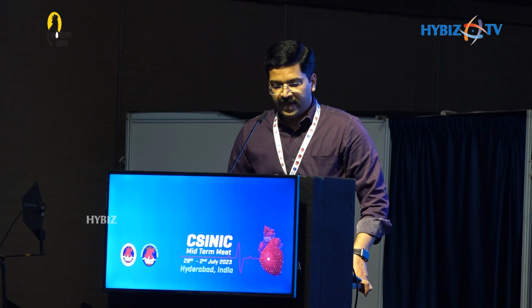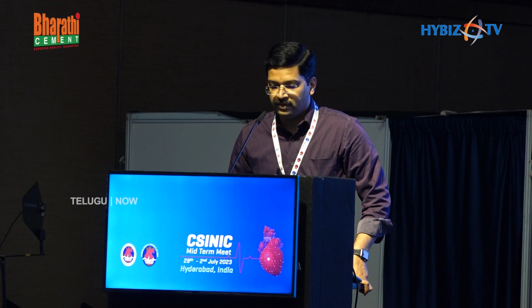Right femoral access, 7 French EBU 3.5 guiding catheter. We engaged the catheter, and it was confirmed by injecting saline and looking for ECG changes and wire confirmation. So we wired the LCX to OM, keeping this reference image. Then we tried to wire the LAD, but it was difficult. As we can see, there are a lot of branches coming out of that point. Then with the help of the wire in the LCX, we could wire into the LAD.